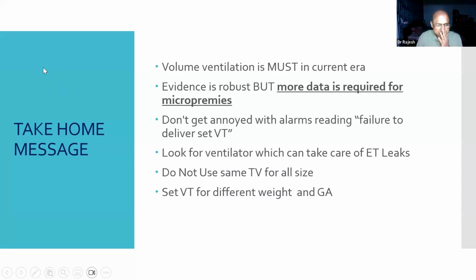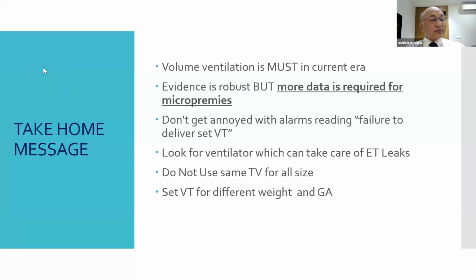I wanted to ask one or two questions. Like how much leak should we accept? It depends on the ventilator.